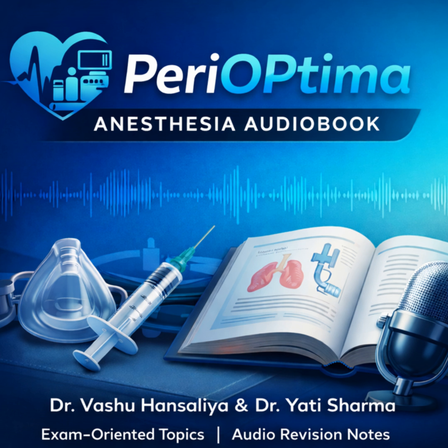If it's VV, you have to remember the heart is on its own. If they get hypotensive, you need inotropes or fluids. The ECMO won't fix the blood pressure. And if it's VA? If it's VA, the ECMO is the blood pressure. Managing the flow rate is managing the cardiac output. Next, check the lines. Cannulation site stability is vital. These are huge cannulas. If one gets dislodged, it is an immediate, catastrophic, fatal hemorrhage.